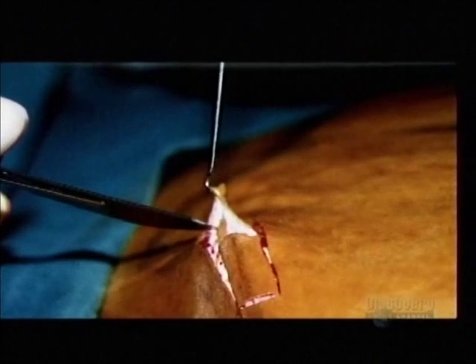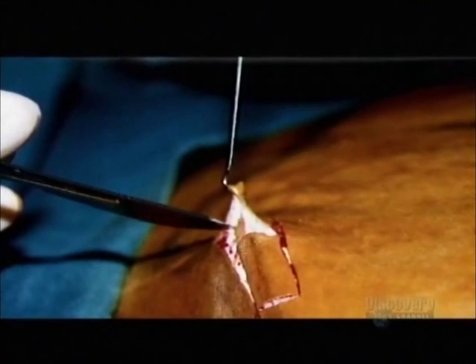What would happen if you were severely burned on your hand, your face, your body? A piece of cultured human skin grown in sterile conditions would help healing faster and also lessen the scarring of the burn. The culturing of skin allows us to save many lives. To grow skin, epidermis cells have to be isolated and made to multiply.